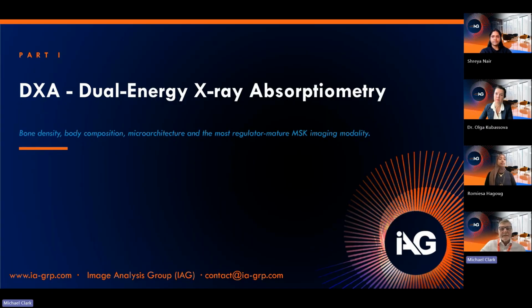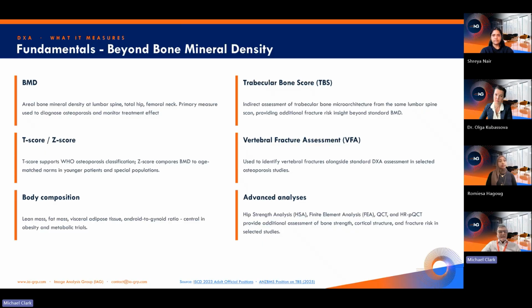Now, that was the general overview. Let's talk a little bit about DXA. With DXA, like I said, it's often seen, it's required in osteoporosis trials. You'll see it in osteogenesis imperfecta, rare bone disease, sometimes osteoarthritis, definitely in oncology trials where there may be an effect on the bone, let's say a prostate cancer trial.